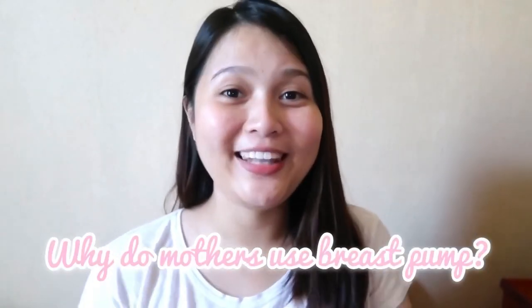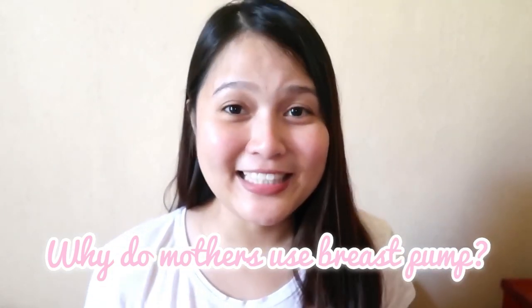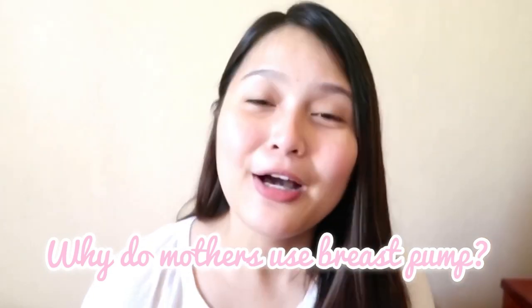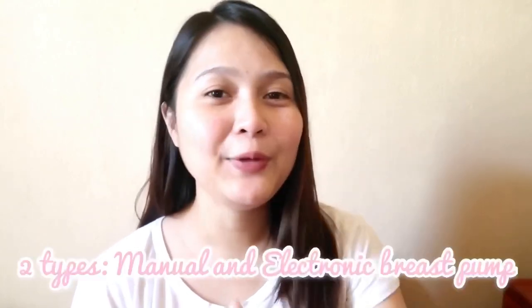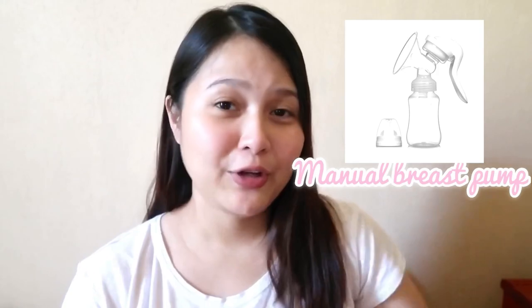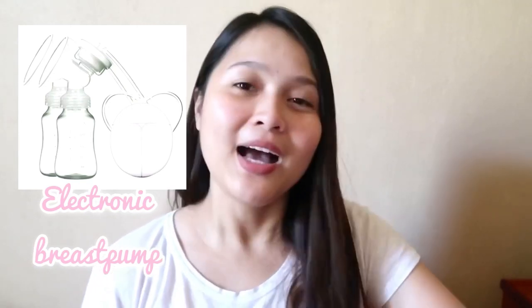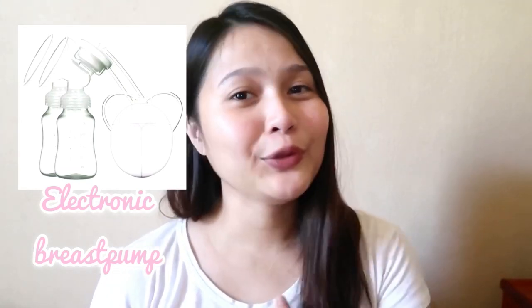First things first, bakit nga ba kailangan ng mga breast pumps ang mga lactating mothers out there? So technically, yung mga breast pumps ay nag-a-assist kay mother na mag-store ng madaming milk for baby when she is not around. So there are two types of breast pumps, manual and electronic breast pumps. So yung manual, by the word itself, kailangan mo mag-exert ng effort para maka-expel kayo ng breast milk. On the other hand, ang electronic breast pump naman, ito yung hindi ka na kailangan mag-exert ng effort, kusa na lang yung machine or yung breast pump na yun ang gagawa or mag-exert ng effort in order to expel breast milk.